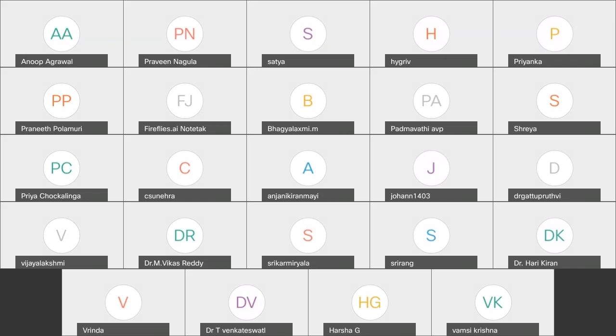Sir, what is the maximum left ventricle LV thickness on echo, sir? Is it more than 30 mm? Okay, so this is an apical HCM, right? This is not asymmetric hypertrophy. So we are only going to measure the apex, not the septum. Septum is not thickened at all. Praneeth, do you remember what is the apical diameter on echo for this patient? It was a screening echo which I did, Anup, so I could not take the measurements. Okay, so for the apical HCM, we don't know the thickness, and truly speaking, we can talk about how much thickness of the apical HCM matters in these kinds of cases. So that information we don't have yet.